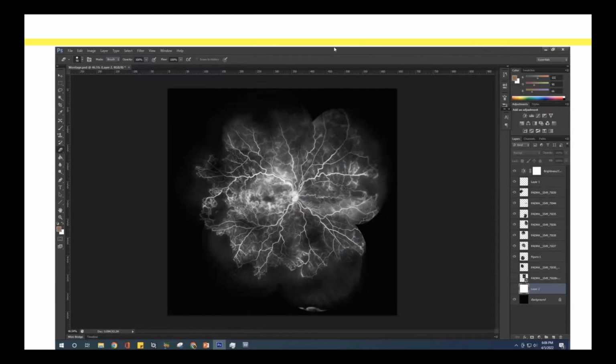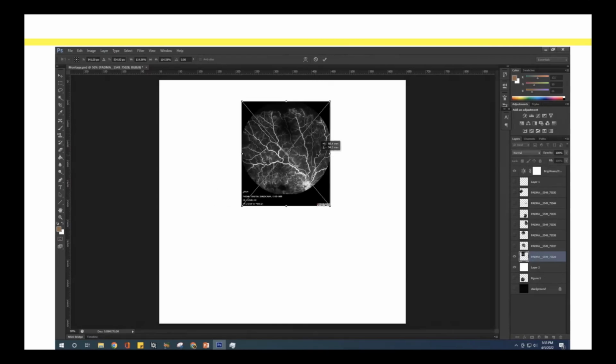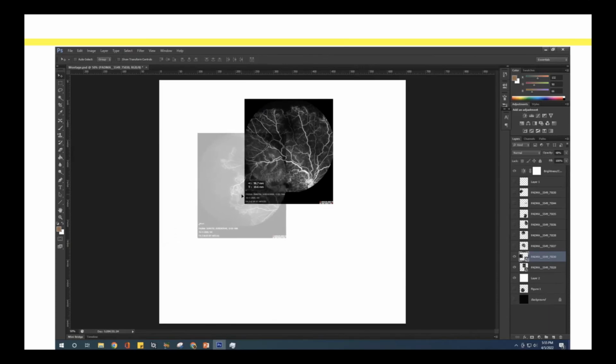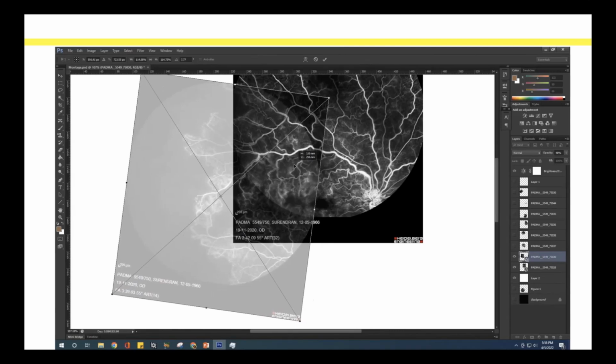Right. So moving into some more advanced features in editing, which was done manually before these tools came in, but I just thought this is a very good forum to pitch this idea for people who are enthusiastic. So this is Photoshop, and this is the end image of one of my patients. So let's see how we got into this. You can see, of course, this is a Heidelberg FFA image where we are taking all these 7 or 8 images, different sections. You see how a simple Photoshop itself was used by the vessels here.